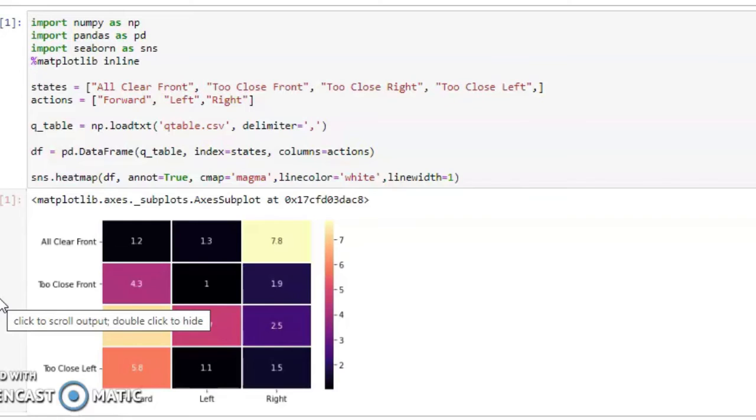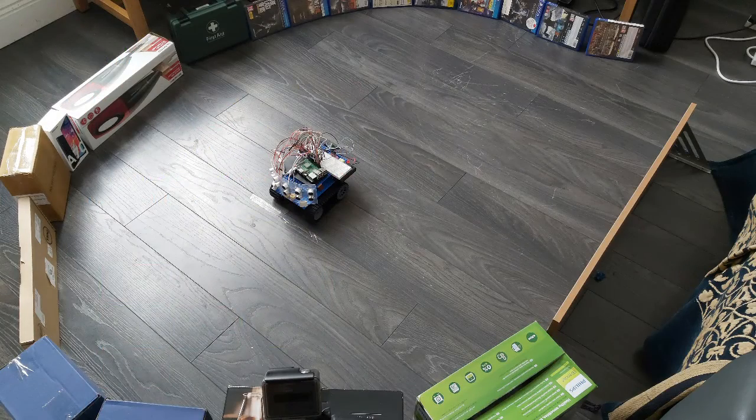With the Q-table saved from the learning sessions, we can then use the information to create a heat map. In this heat map, we can see the key focus that the agent uses to make the decisions. Up next, you will see the test of the learning sessions.